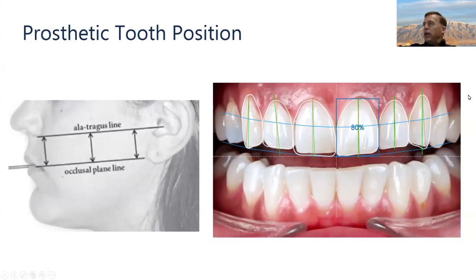Another thing that can look kind of weird is you look at a tooth and you're like, man, this area just looks weird on it. Some of the CAD programs that we use these days, when you stretch it, it creates a depression here. And in the overall contour, we want our tooth to be convex in this dimension and convex in this dimension.